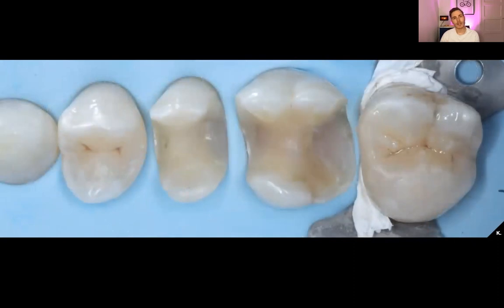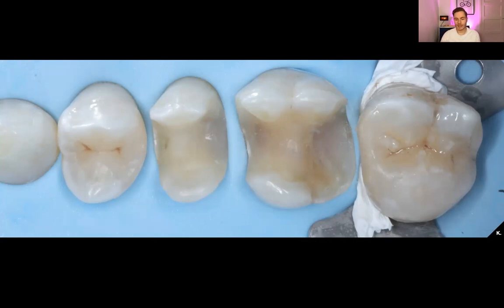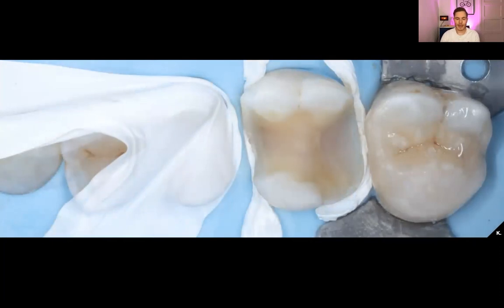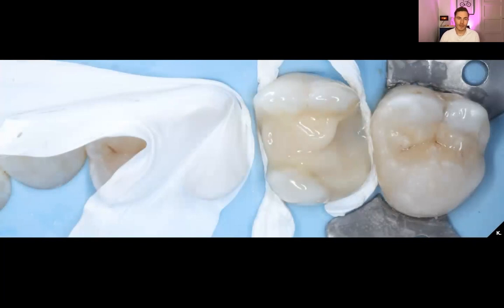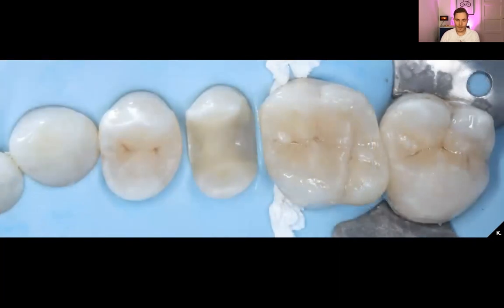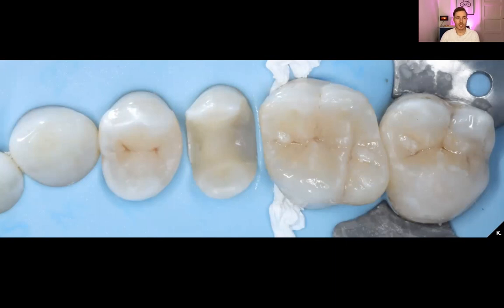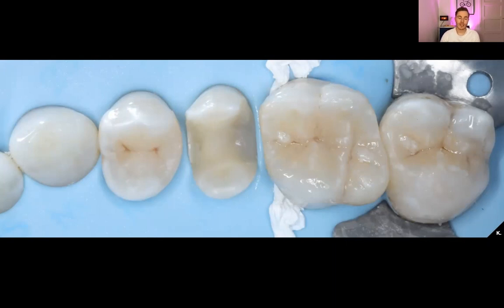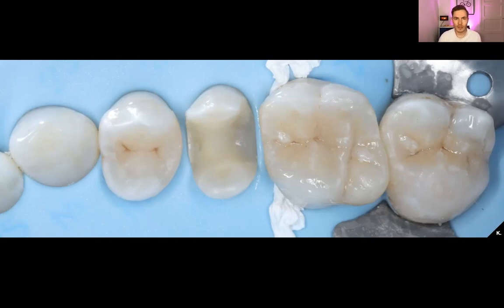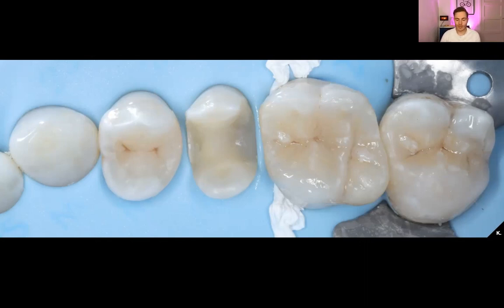Then I go on to the first molar. I place the Teflon over there, cover the neighboring teeth, and then cement that one. Here you can see the Teflon in place and I place my composite directly on the tooth and then put my indirect restoration on there. This is what it looks like after cementation, after removing all of the excess — no polishing was done here. You can see that the integration of the margin is already really good and there's a really nice fit; otherwise you won't have this result only after removing the excess composite.